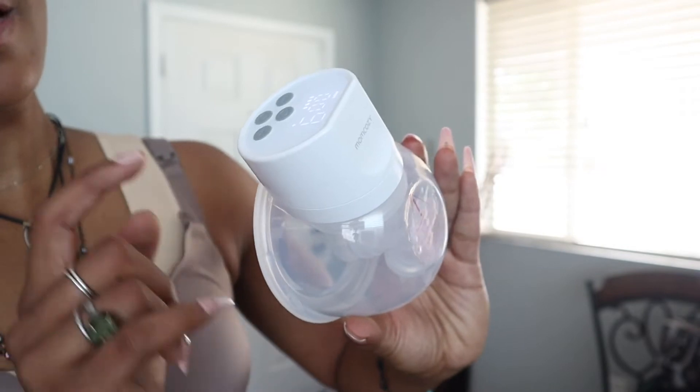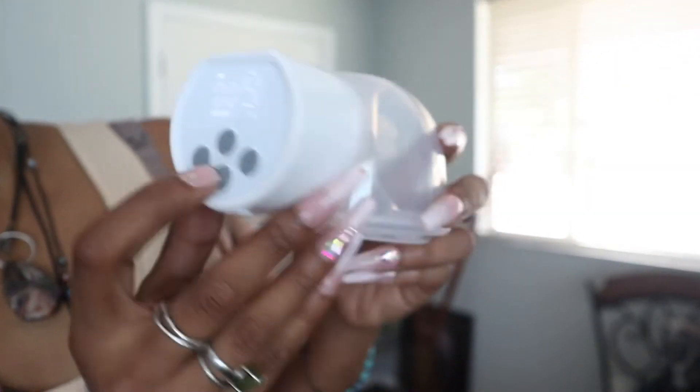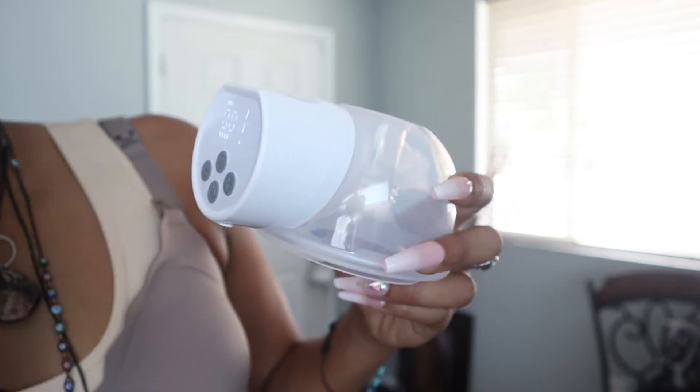You can go through nine different intensities on here. That's actually at its highest, all the way down to one.